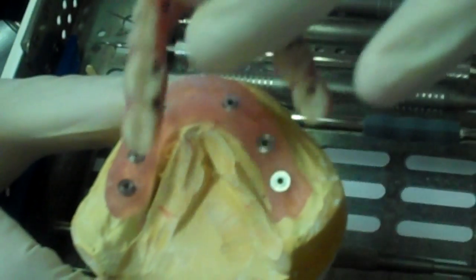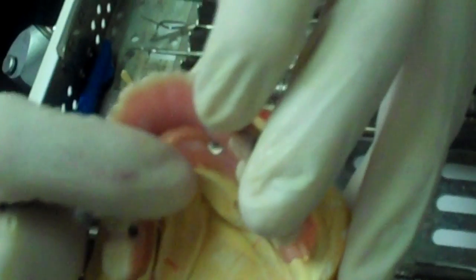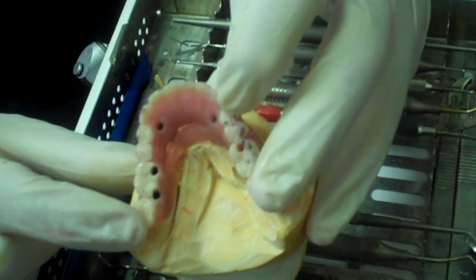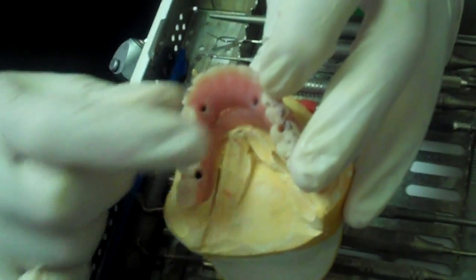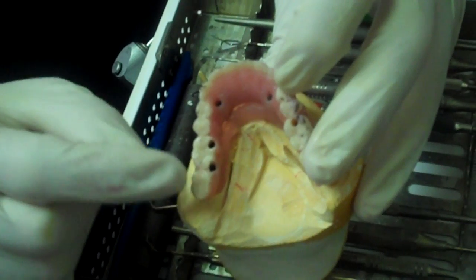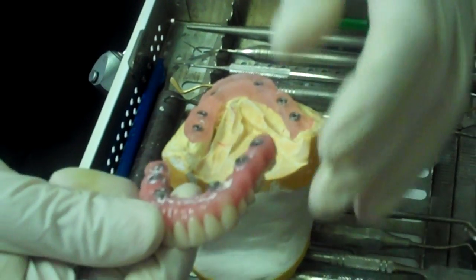So it fits right on top — very, very secure. Those screws are permanent. The holes are filled with an acrylic denture resin, or acrylic tooth resin, that looks just like a natural tooth. And this prosthesis can be removed quite easily by removing the resin and the screws, just like we just did. So here it is.